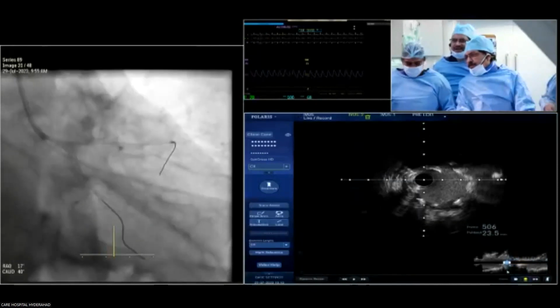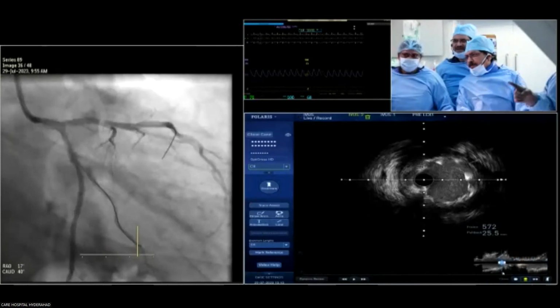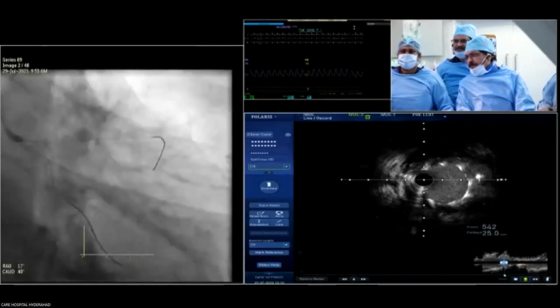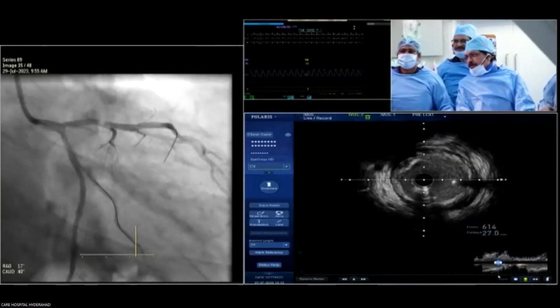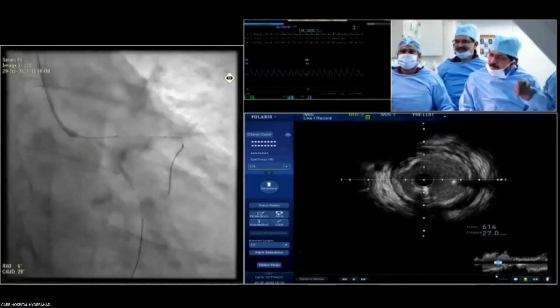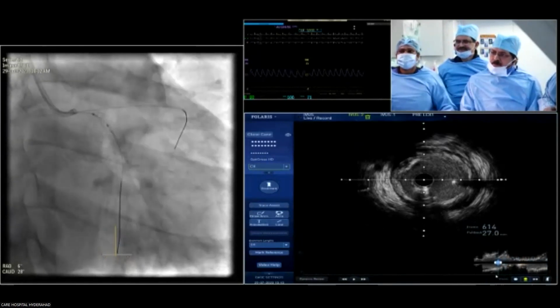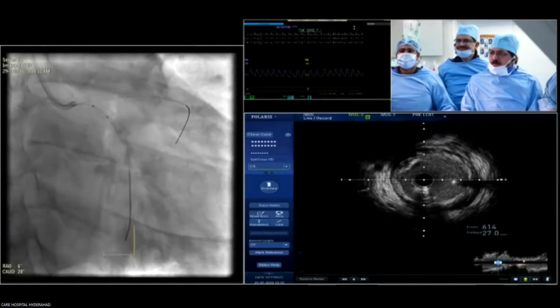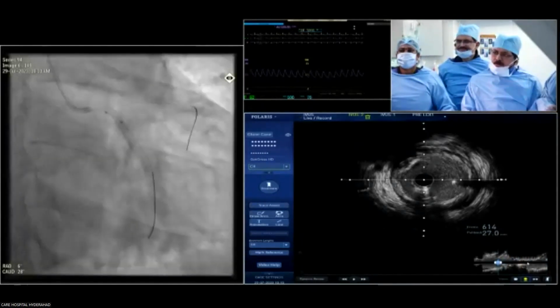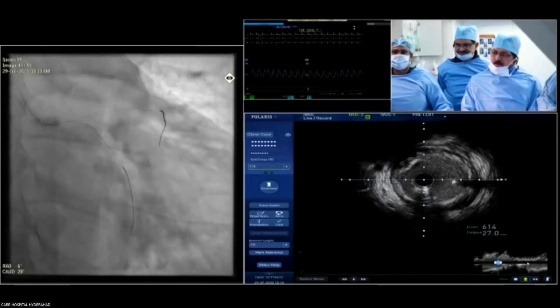Because if you slowly pull this back right here, okay, right there. Just come back, go forward right there, right? So just as your LAD wire comes in, right there. Okay. Now your left main is formed, but your struts are not touching the side. Yes, exactly. So you can take a short non-compliant balloon, size it to the distal left main, open it, and rewire the LAD, because effectively that becomes your distal left main POT. Rewire the LAD through the struts, and then you do a kissing balloon inflation, which is effectively opening the struts over the LAD.